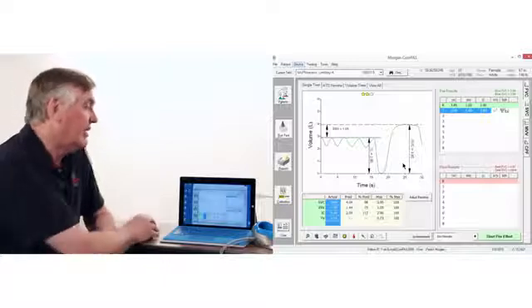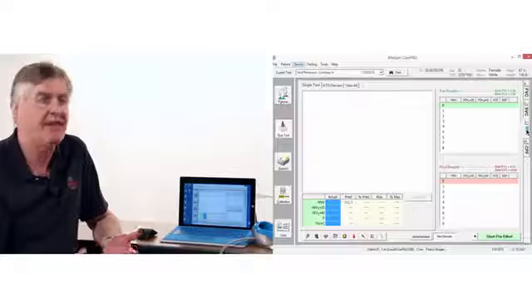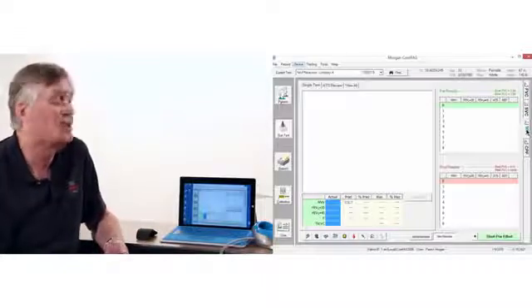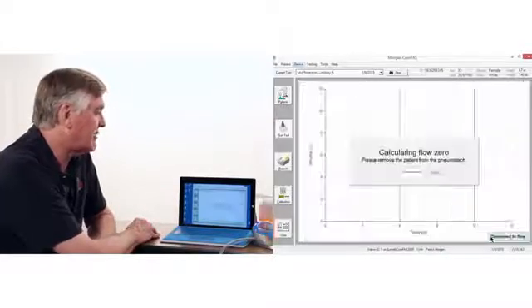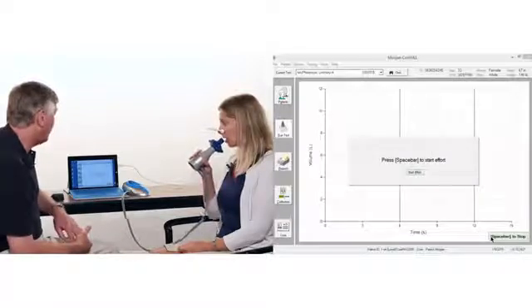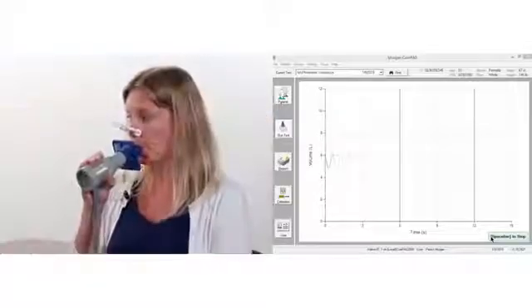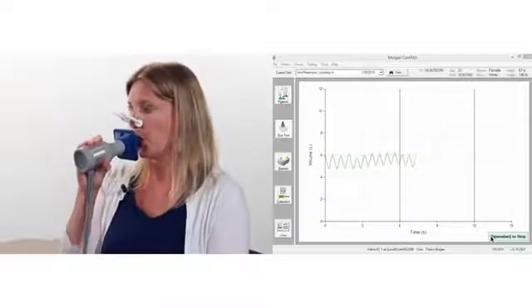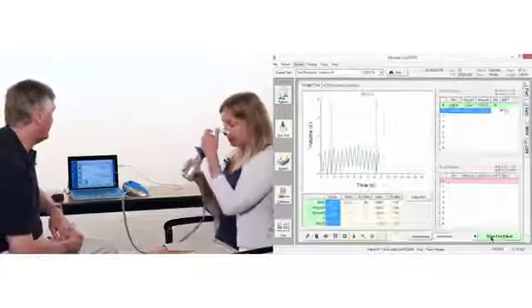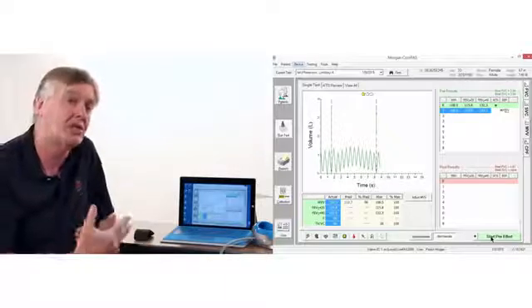The unit can also do 2 measures of neuromuscular function. One is MVV, maximum voluntary ventilation, and the other is cough peak flow. We'll start with an MVV, and in this test we simply ask the patient to breathe deep and hard, so off you go, and we hit the space bar when they're doing so, and we try to get them to go to 12 seconds. I'm going to deliberately cut it short, just so that you can see that you can stop the test between 6 and 12, and it will extrapolate.